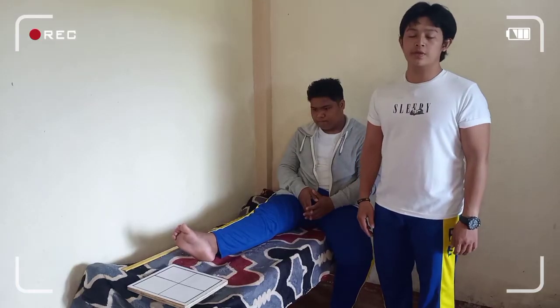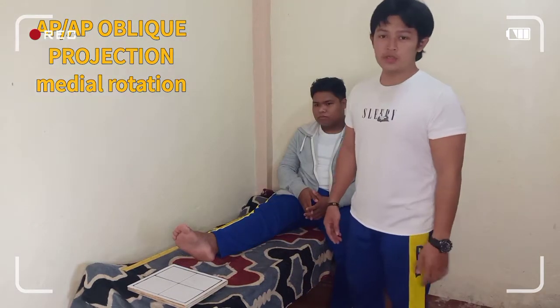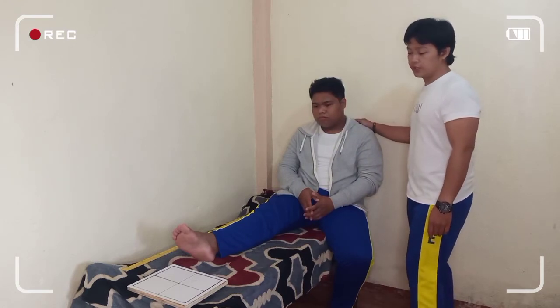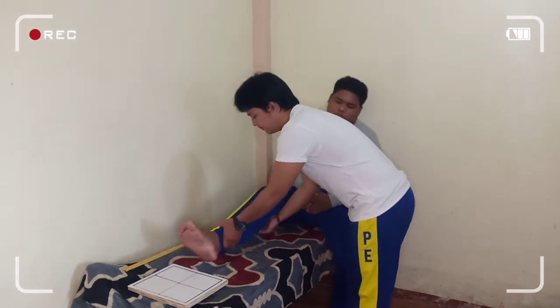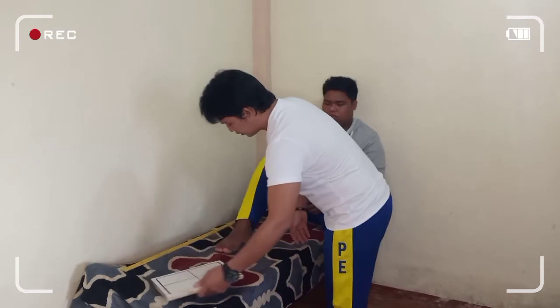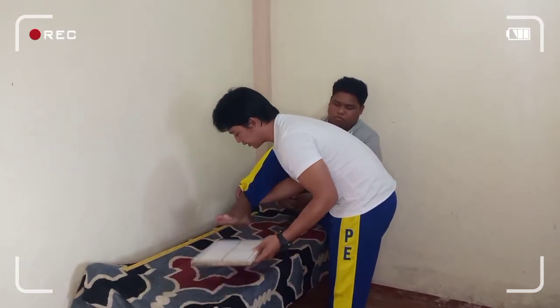The second projection of the foot is the AP oblique projection, medial rotation. First, sit the patient or place them in supine position on the radiographic table and flex the knee on the affected side. Place the plantar surface of the foot on the image receptor.